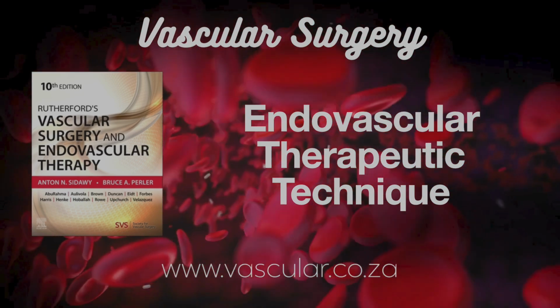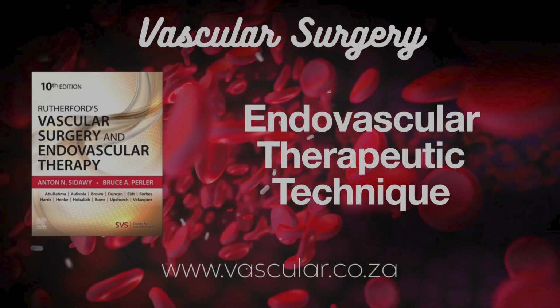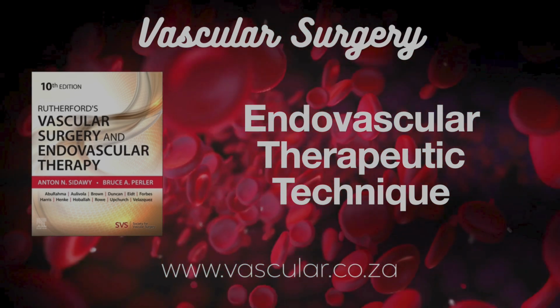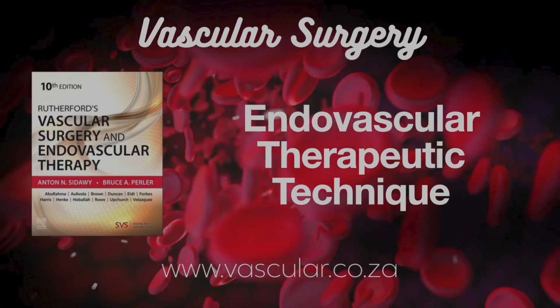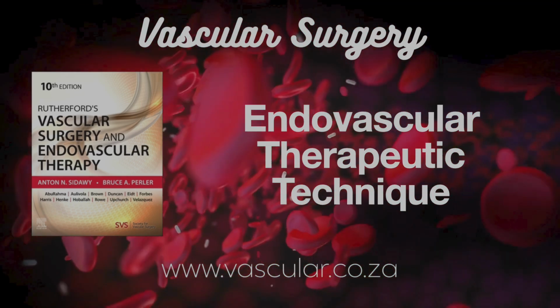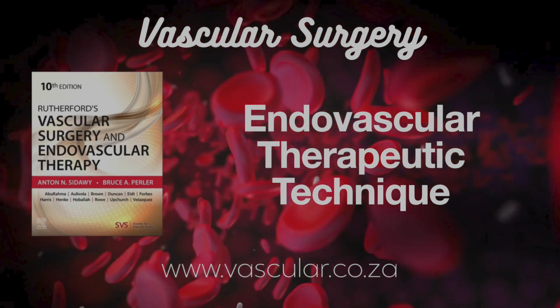We have both BES and SES versions. Let's start with the balloon expandable covered stents. Examples include iCast, Viabahn VBX, though VBX has some self-expanding properties too, LifeStream, Jostent, BeGraft. The iCast is stainless steel covered with PTFE. One feature is you can expand it beyond its stated size, but it might shorten a bit when you do. Wire and sheath size: usually 0.035-inch wire, 6 or 7 French sheath, depending on size.